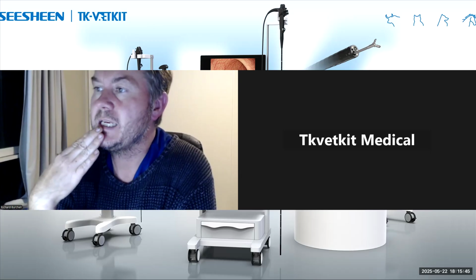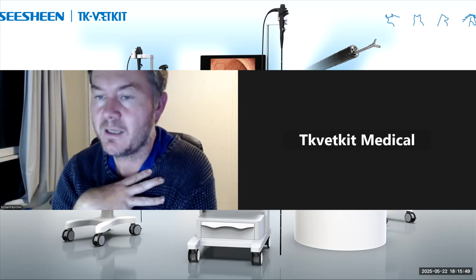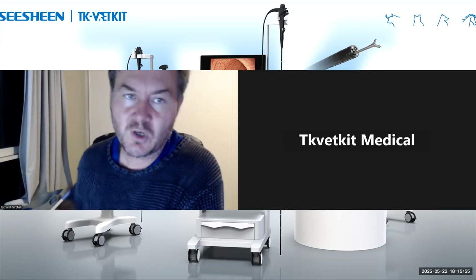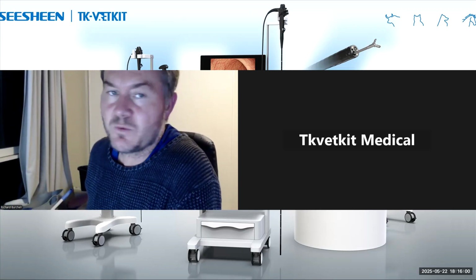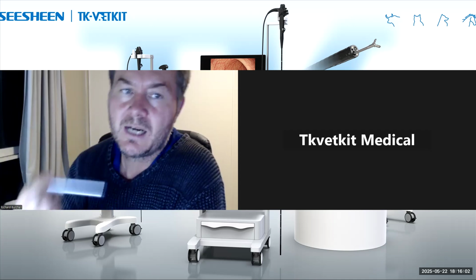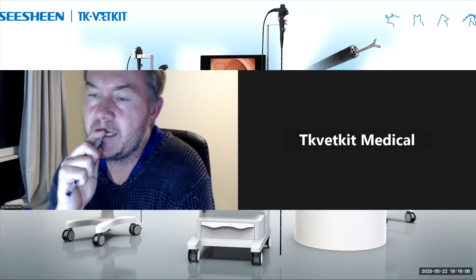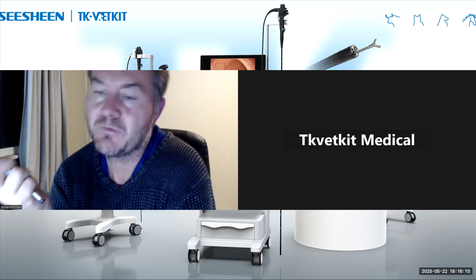I've only seen one dog over my career, fortunately. It wasn't a scope I was doing. It was one that I was watching, where a dog bled to death after a nasal biopsy, but that was a greyhound and probably a hyperfibrinolysis case. So yes, they do bleed, but it is quite rare to have life-threatening bleeding.